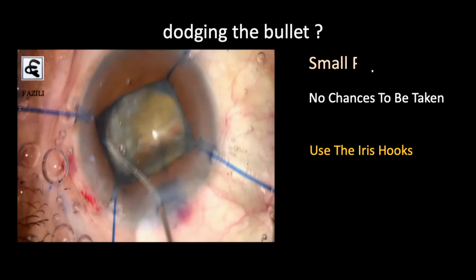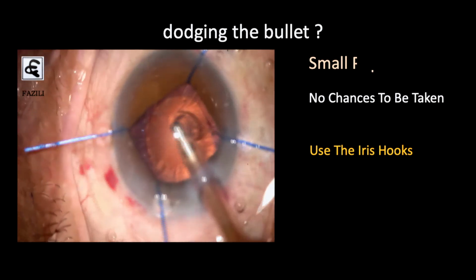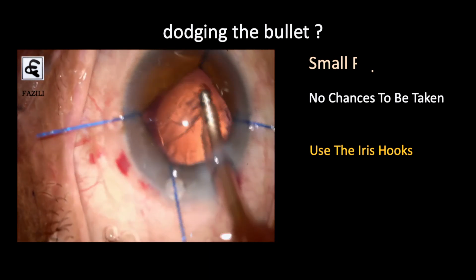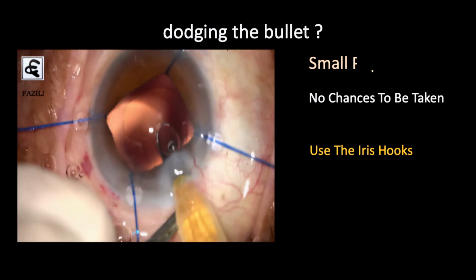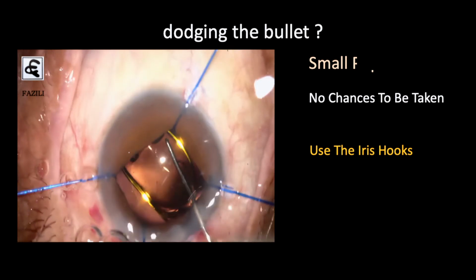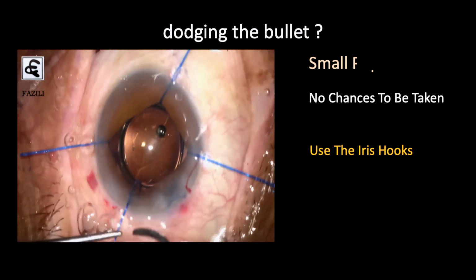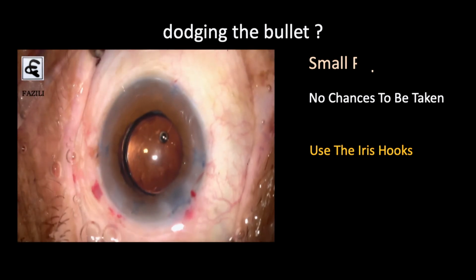Once that is done, it is all very important, like Dr. Reena said, that we dial the nucleus, do a nucleotomy, the safe way, watching the bag, do a nice cortical cleanup, and then we inject the IOL. Sometimes it is good to remove the two hooks on the sides of the main port, because there may be some tenting, and while you're going inside, you might actually hurt the iris there. So here we have injected first and then removed all the viscoelastic after that.